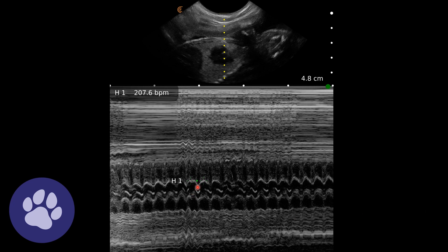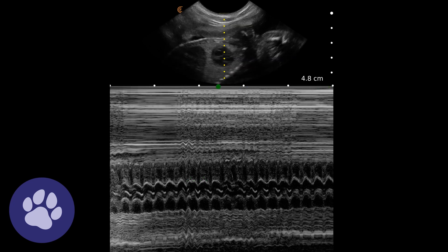Here we've got a heart rate of 207 beats per minute, which the machine has helpfully worked out for us. Here we can see that close-up of that heart beating.